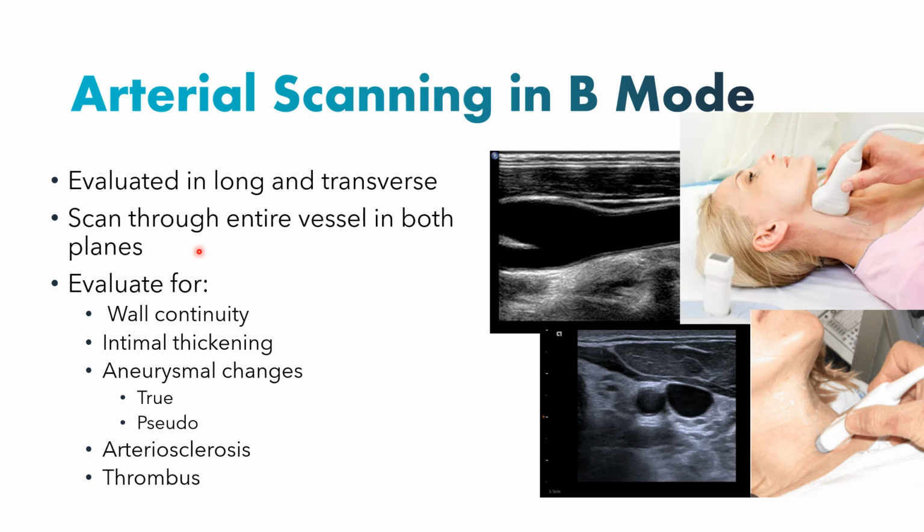When you get to the longer vessels of the leg and arm, that can be a little bit more challenging, so we'll teach you the spots that you want to pay special attention to. In a general imaging suite, we would go through the vessels all the way through the entirety of the vessels to the best of our ability.